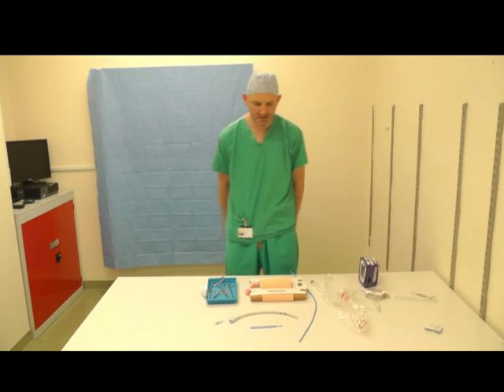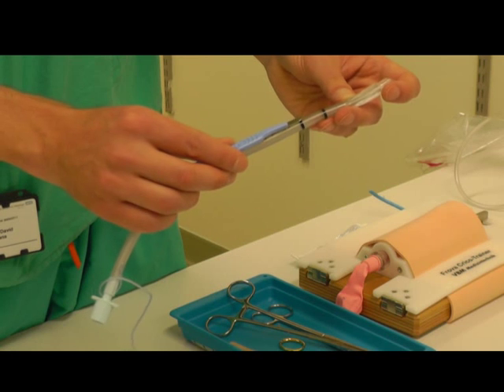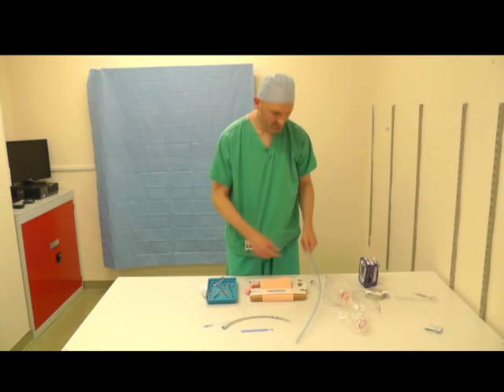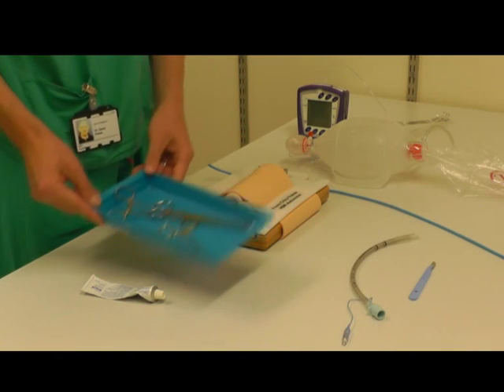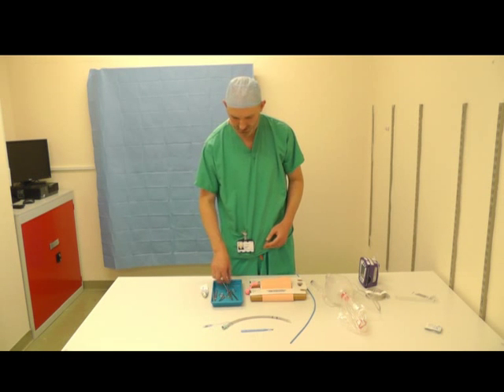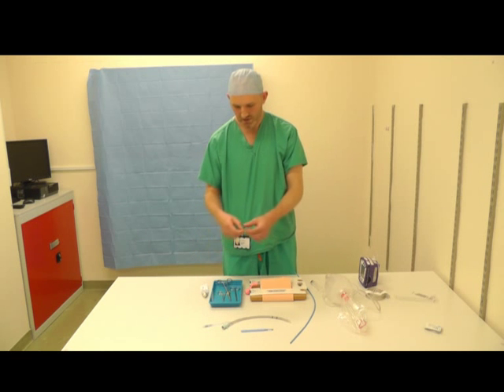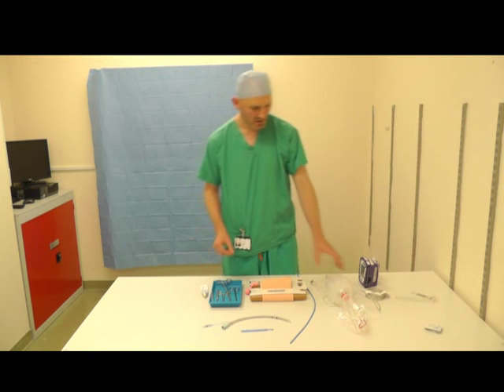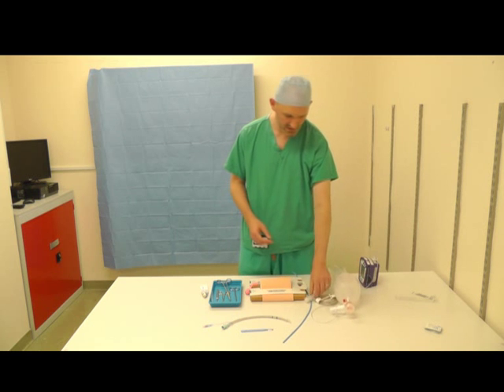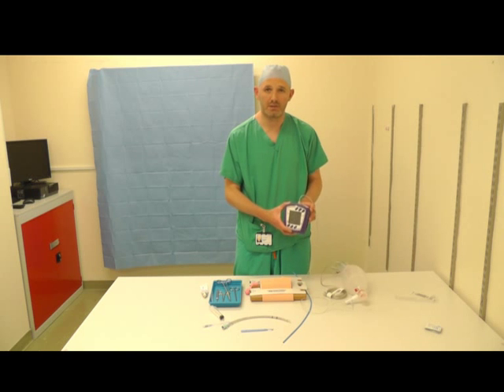Okay, so looking at the equipment you'll need, a size 6 endotracheal tube, a number 10 scalpel, and if you notice that these are exactly the same size, same diameter, a bougie, an emergency cricothyroidotomy set from the difficult airway trolley, which contains a sponge holder, some scissors, a needle holder, and a tracheal hook. A means of ventilating, in the first instance this will be a self-inflating bag, a syringe to blow the balloon up. So finally you'll need a capnograph to confirm end-tidal carbon dioxide.